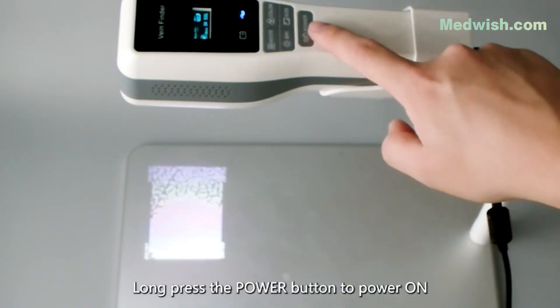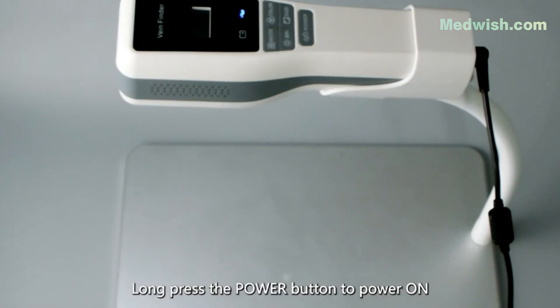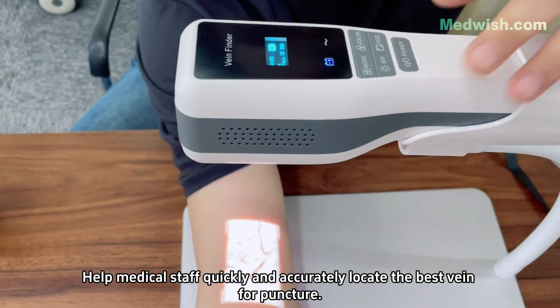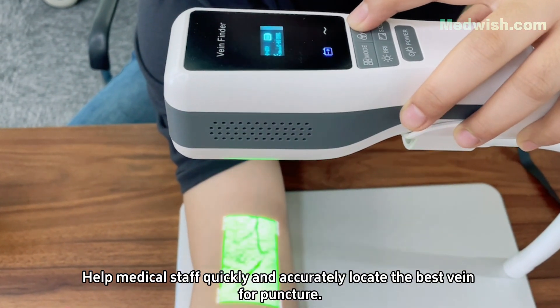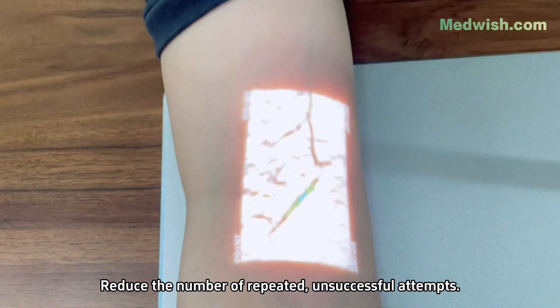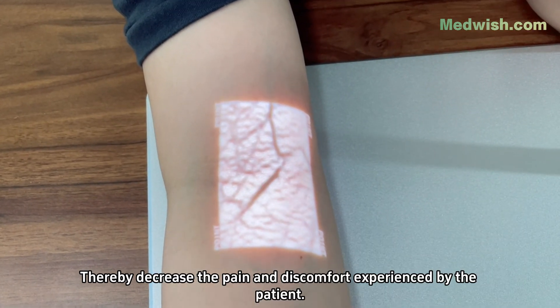Long press the power button to power on. The vein detection device can help medical staff quickly and accurately locate the best vein for puncture. Reduce the number of repeated unsuccessful attempts, thereby decreasing the pain and discomfort experienced by the patient.